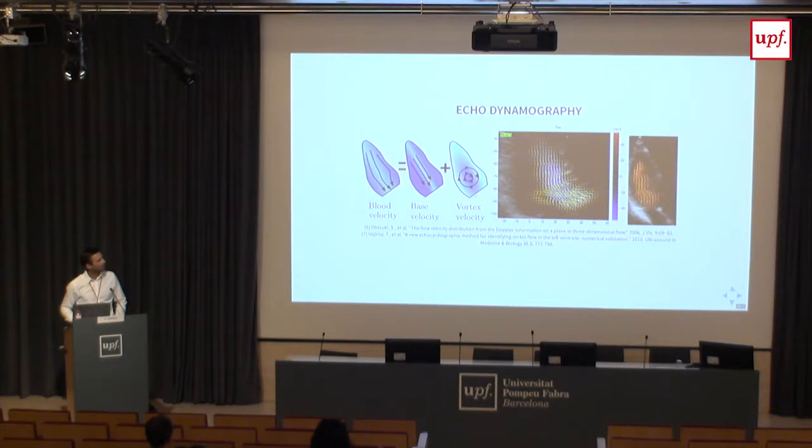So this technique basically makes a lot of assumptions. For example, it assumes that this vortex is symmetric, which perhaps is fair enough in many cases. Using this assumption, you can figure out the components that you don't have in this flow. And then for the laminar flow, you just assume that there's no through-plane flow. So using the continuity equation, pretty much in the same way we saw before, you can resolve this, and then you sum them up again, and you end up with your flow field. It will look a bit like this.